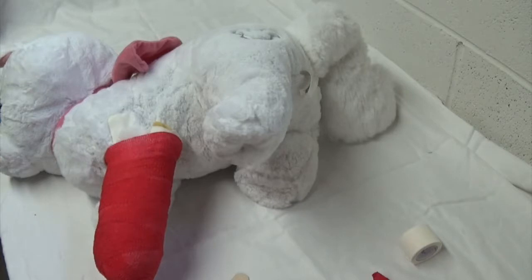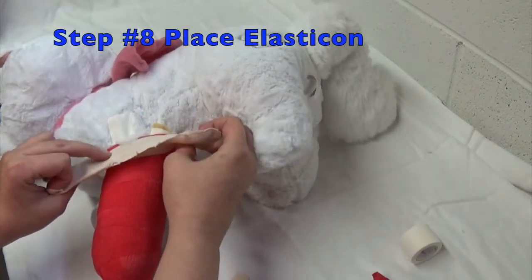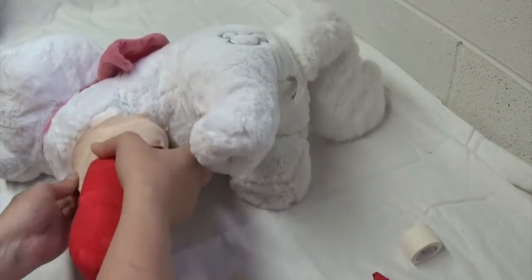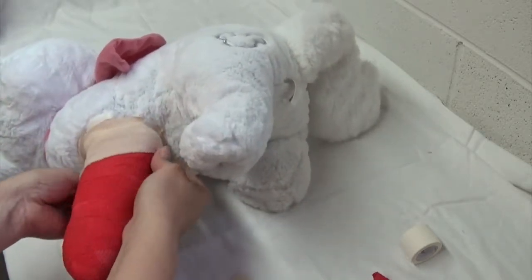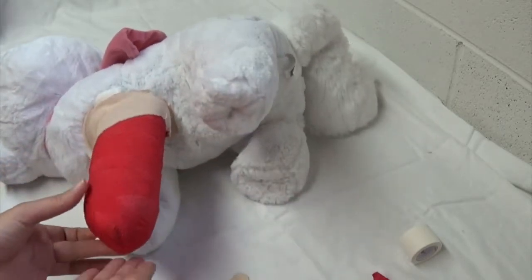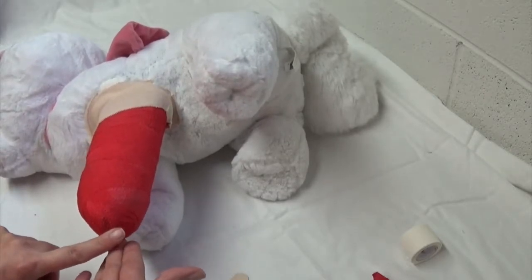The stirrups are what help keep the bandage on. Place the Elasticon so that about half of it is going on the bandage and about half is going on the skin — hopefully not hair, as that's going to be painful getting off. You can place another little bit of Elasticon on the end to help with durability of the bandage.